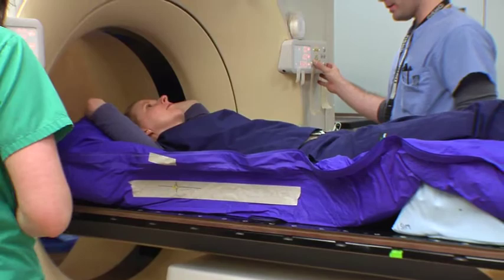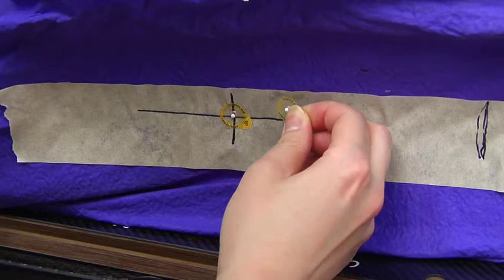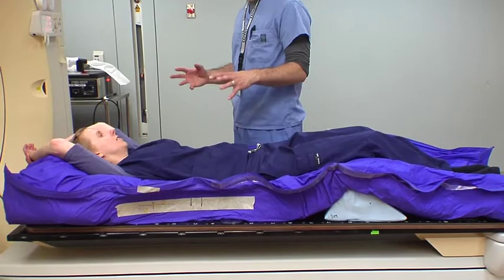We're going to put a BB below on my side and above on Erica's side. Then we're going to have you go ahead and get up and out of the bag so we can put some little BBs in the back of the bag — they can see exactly where you're laying for positioning for the CT.